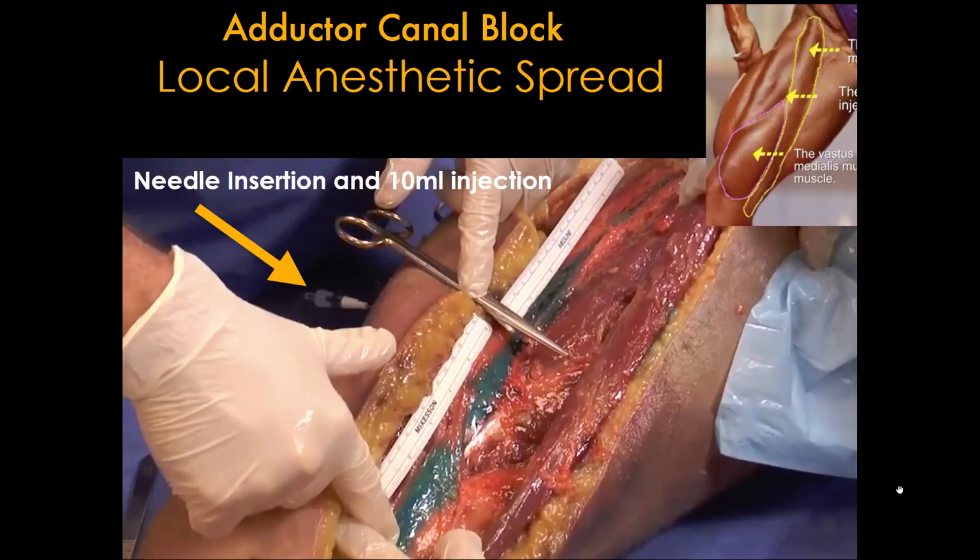This is Brandon Winchester's and Hickman's work where, with Indian ink dye, it spreads up and down. So I know we're asking where should we be, here or there, but it's going to spread up and down. So you get good spread.